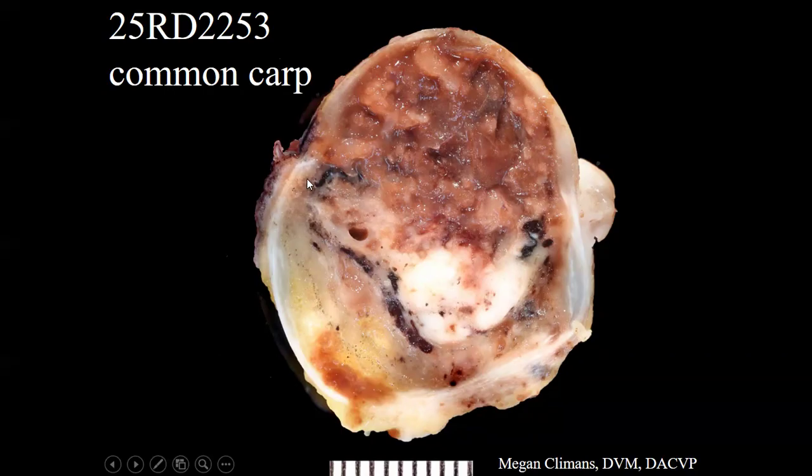So this is part of our choroid here. And then the iris here, which is kind of a cute little iris. But the iris is maybe displaced or distorted on the other side. It's hard to make out the uvea elsewhere. Fish do have fat in their suprachoroidal space normally, so a lot of this probably is fat, but it looks abnormal. Too thick, it's differently thick on one side versus the other. So there's all sorts of distortions going on in this globe, and indeed, we can't really easily make out a lens, and it's full of basically soft tissue type stuff, just like they said by ultrasound.